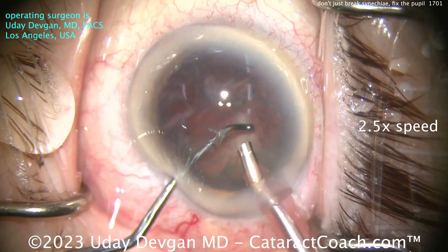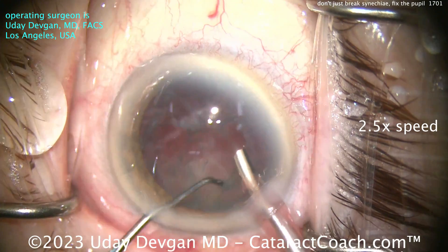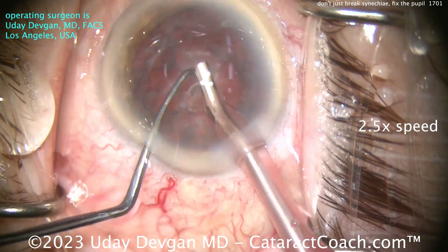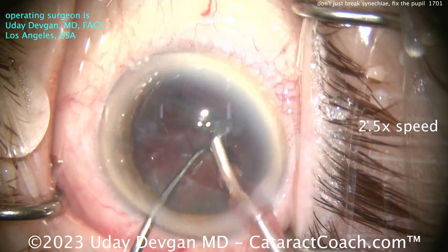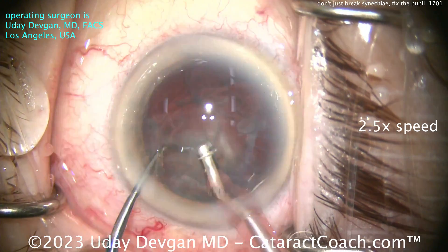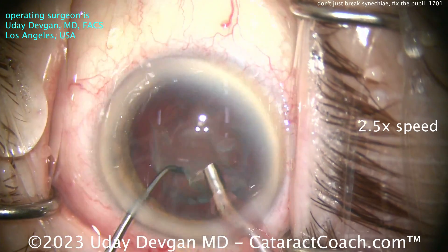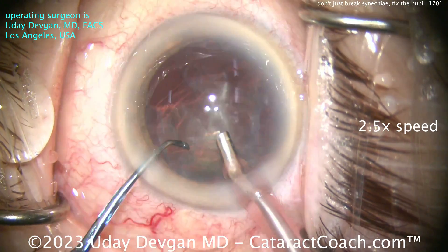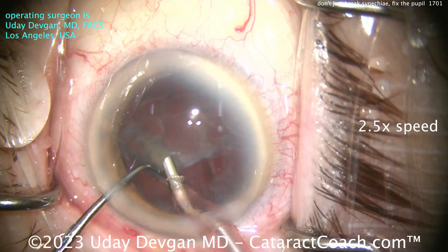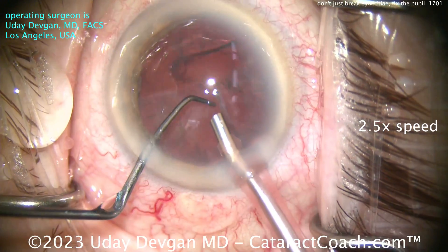With extra iris manipulation, there can be extra sensation for the patient, so putting in intracameral lidocaine at the beginning of the case is very important — that's really going to give you a good level of anesthesia. Also remember that the iris is delicate — it's pretty wimpy. You don't want to be very rough on it; you can disinsert it from the root and have more problems than you ever anticipated. You don't want too much bleeding here. First, do no harm — and I think that's an important lesson in a case like this.